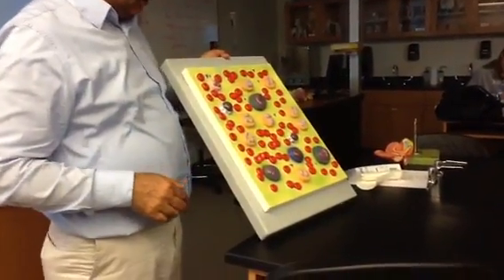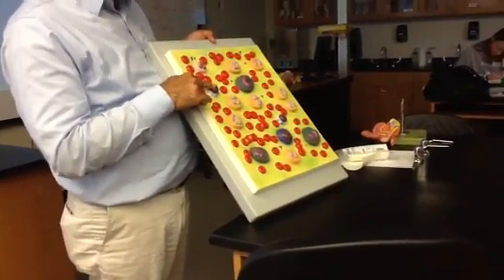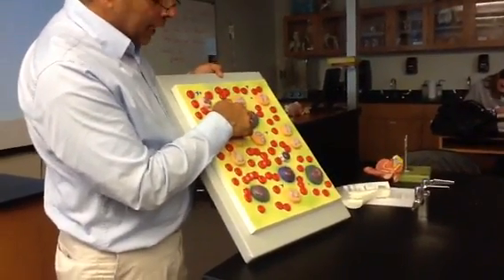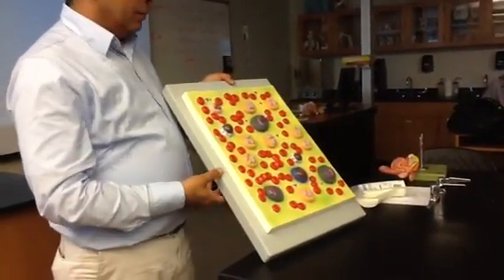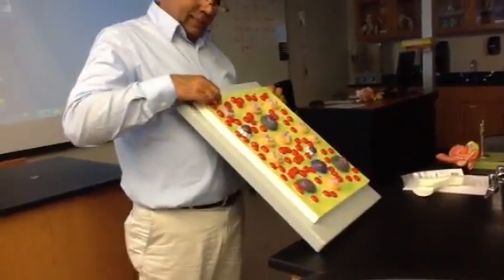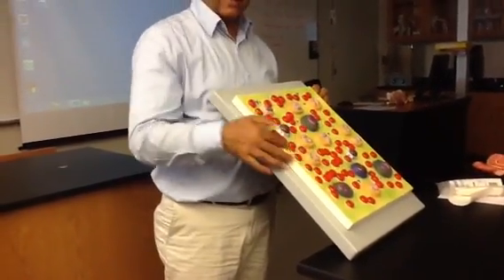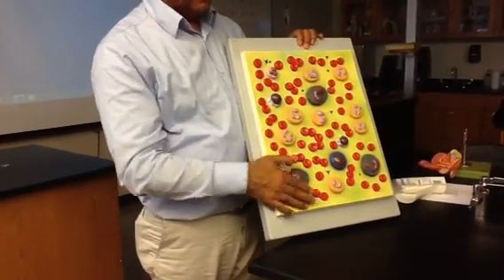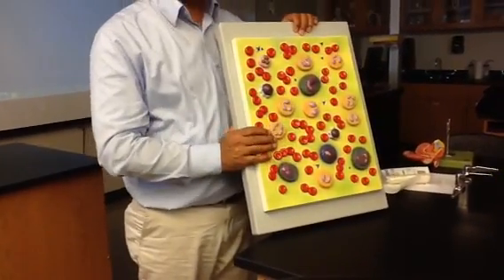So what have I learned with you? What white blood cells have we learned? Basophil, a lymphocyte, a neutrophil, an eosinophil, a monocyte, a small and large lymphocyte. In addition to that, we have cellular forms that are just like cell fragments, which are these. Label number 7. These are platelets. And you all know that these red cells, which are like biconcave discs, which have a depression in the center, are called red blood cells.